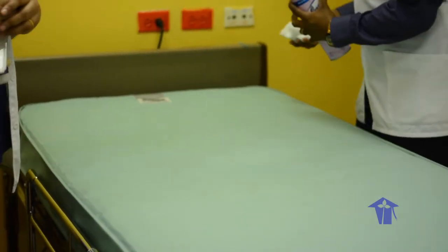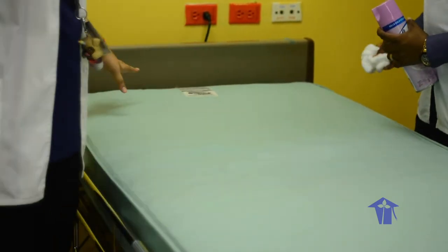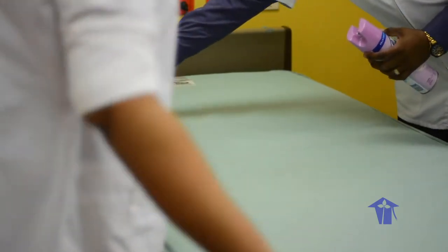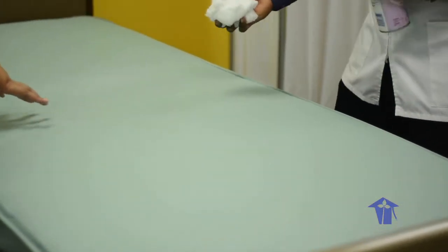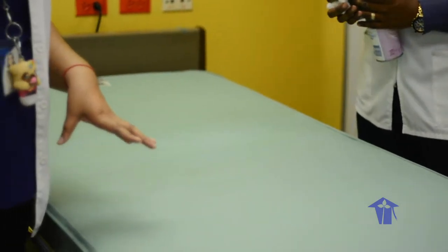Again, you have to go according to hospital protocol, all right? When cleaning, it does not matter how you clean. You just clean the entire mattress, the side rails, the bed heads, and down to the bottom, right? Because you don't know where there may be bodily fluids.